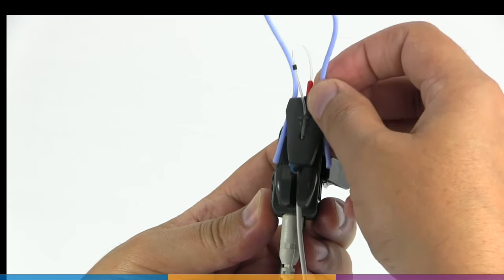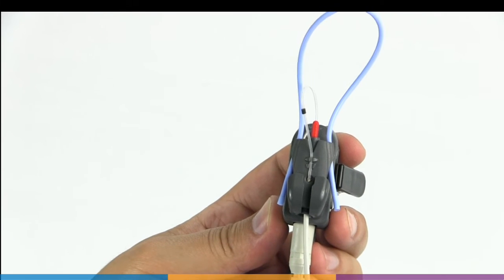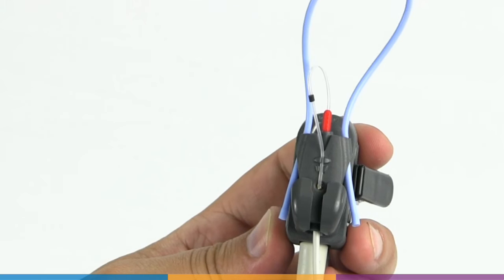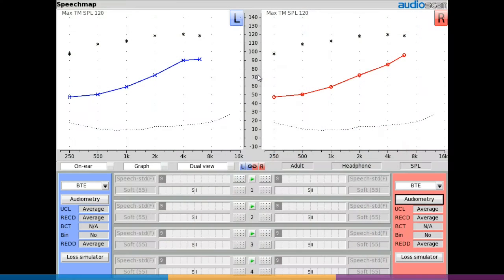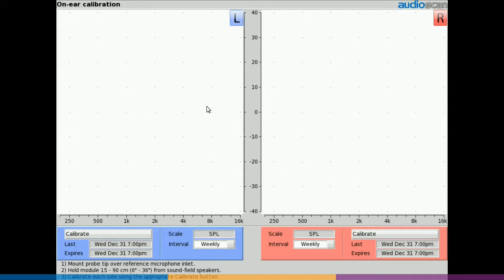Ensure that the probe tubes are correctly positioned over the reference microphones and the reference microphones are facing outward. Right-click and choose on-ear calibration. Hold the probe dock 15 to 30 centimeters or 6 to 12 inches from the speaker with the microphone to be calibrated facing directly towards it.